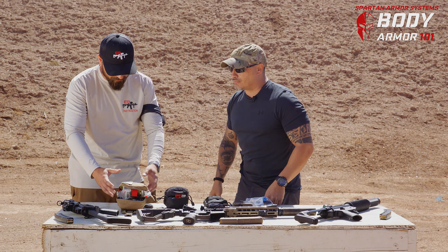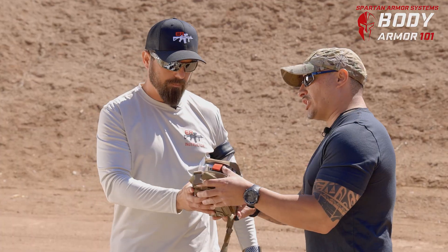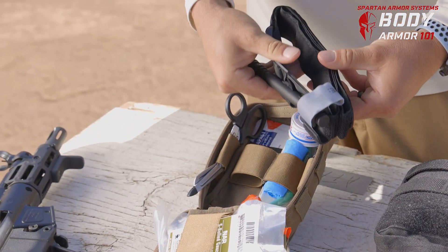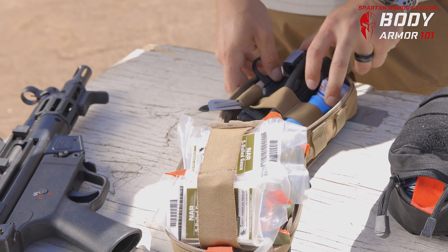Finally, the AFAC is the much more advanced version for the individual. Unlike the First Response Kit, this can usually only handle one patient. It has very similar types of equipment, but it's usually just made for yourself — and as you can tell, it's slightly bulkier.